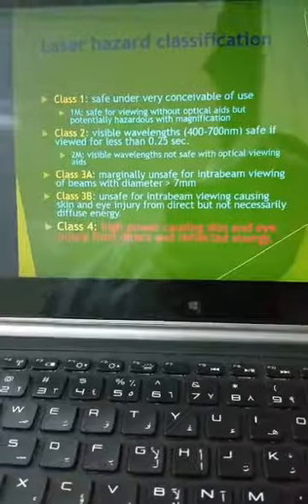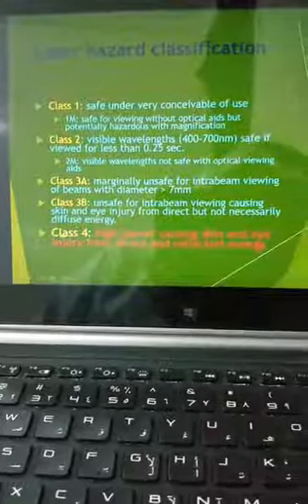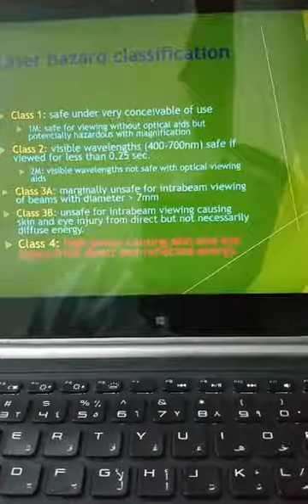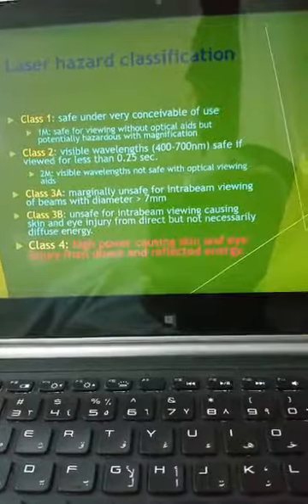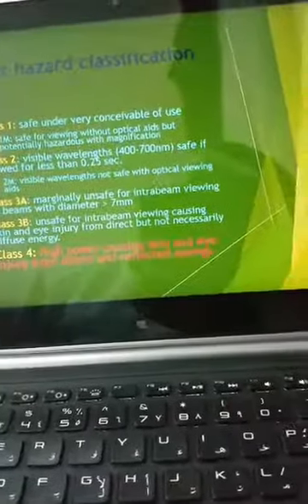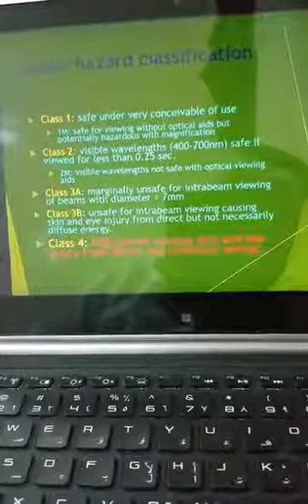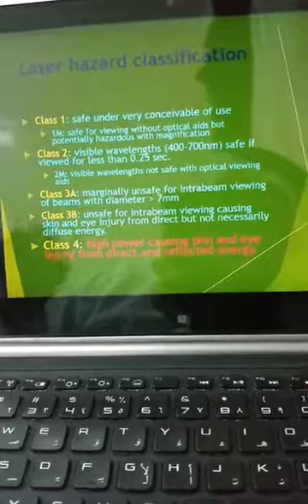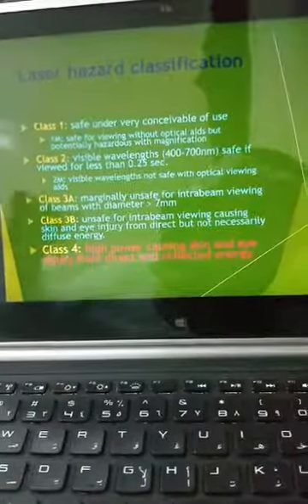And the high-level laser, we consider it a class 4, a very dangerous laser if applied incorrectly. I mean, it is safe if you apply it safely. Is laser dangerous? No, it is not dangerous. I would say the knife is dangerous if you apply it in an incorrect way. If you're using a knife, you have to be careful to cut only the area of interest. Same thing with the laser. You should direct the laser to the target, but in addition to that, you should know the type of laser and the power and energy density you are using. This is very important to avoid damage.